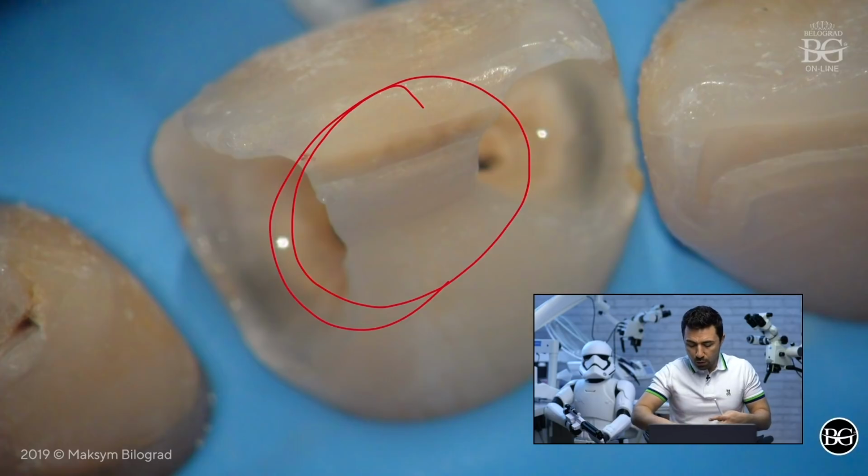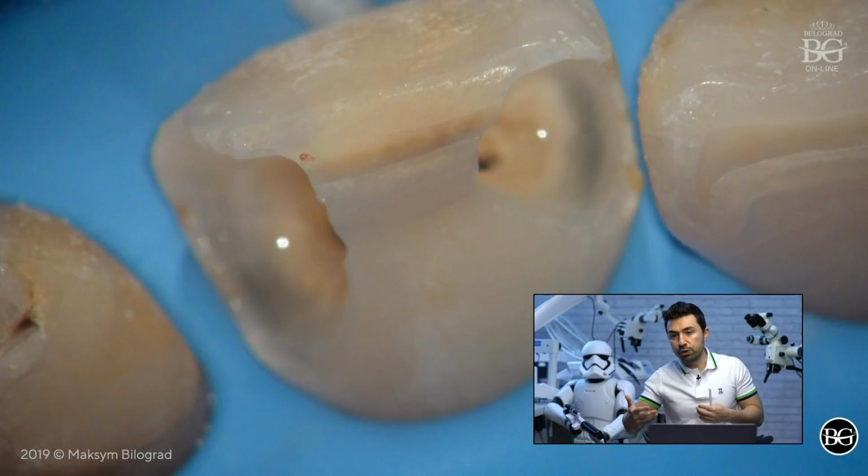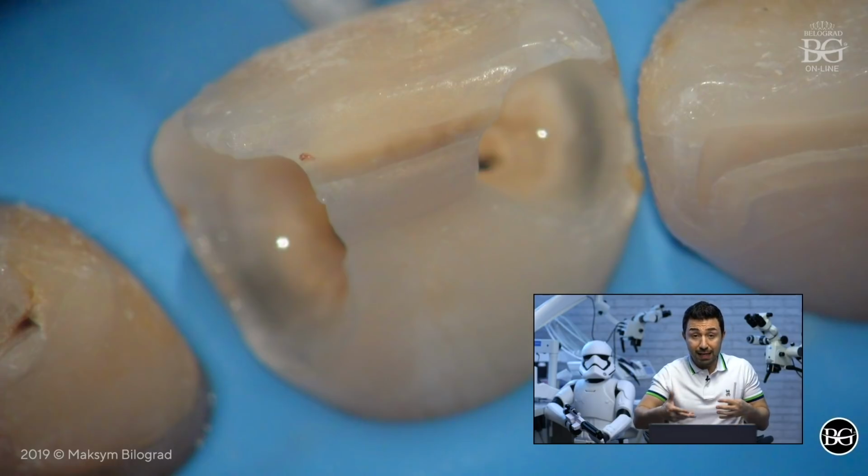So in the approach that I'm sharing here with you, our endodontic treatment will be minimally invasive, and if we use a metal-free ceramic restoration for aesthetic and functional treatment, as in this case, we can also do minimally invasive preparation from inside and from outside as well. So this tooth will benefit from the minimally invasive approach.